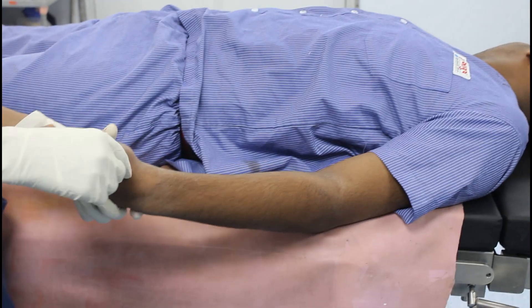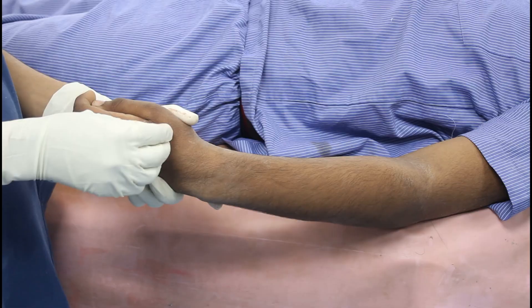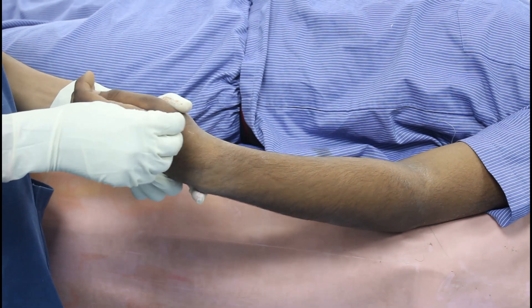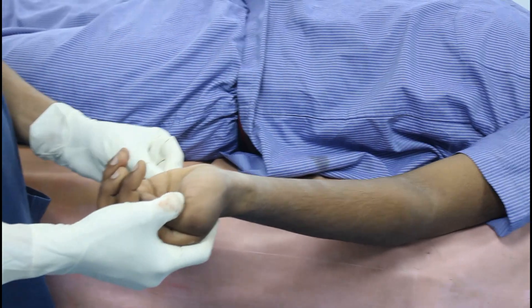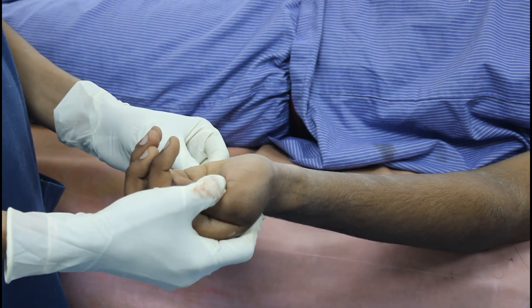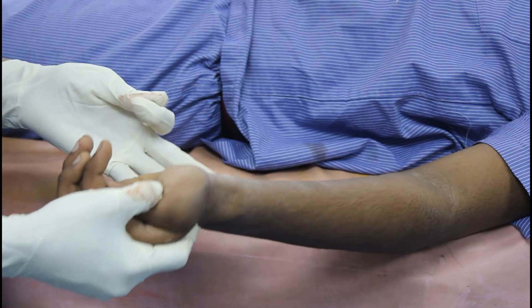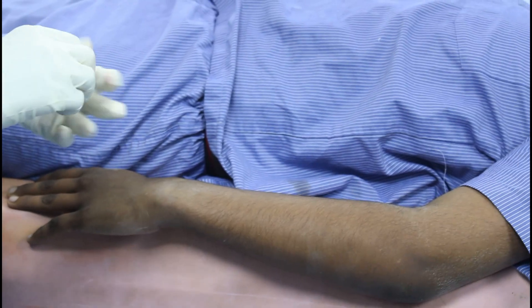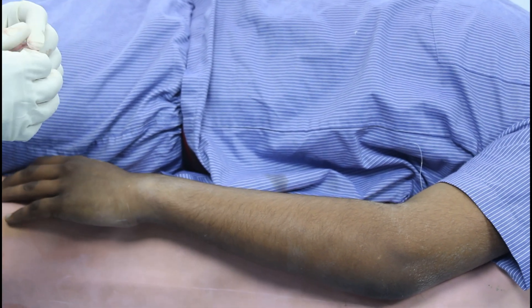Now I will pinch on the lateral side. He is not able to recognize the pin-prick sensation on the lateral side, so my median nerve is adequately blocked. Now I will check on the medial side. On the medial side also he is not able to recognise the pin-prick sensation, so my ulnar nerve is blocked. To summarize: to check the radial nerve, median nerve, ulnar nerve, and musculocutaneous nerve, we do these four maneuvers — and if he is not able to do them, that means our block is complete.